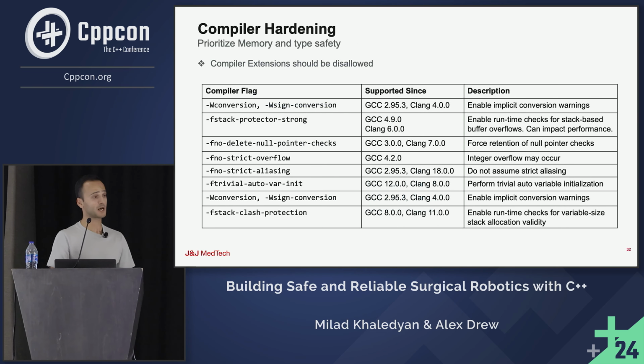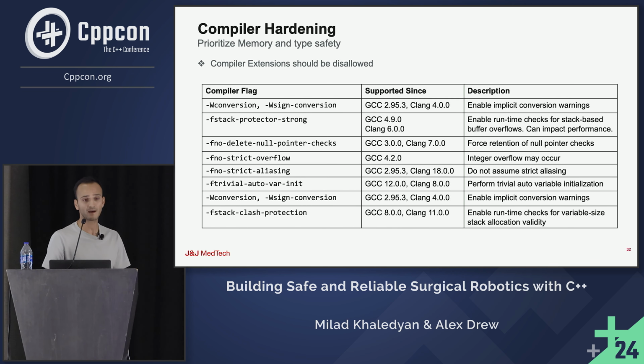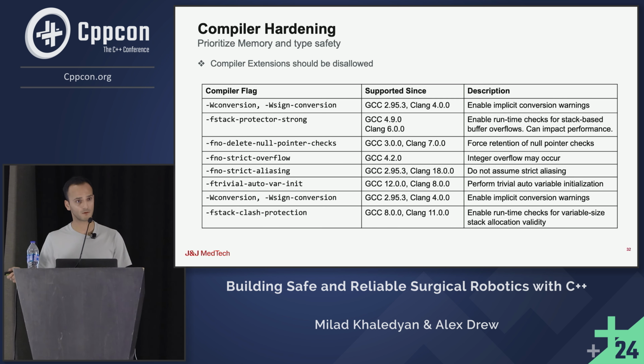So I have a bunch of examples here. Some of them are basically just compile time, so it won't let you compile your code. Some of them are runtime flags. For instance, some of them are static, and the FDA actually recommends you should not have any warning or any error when you release software.